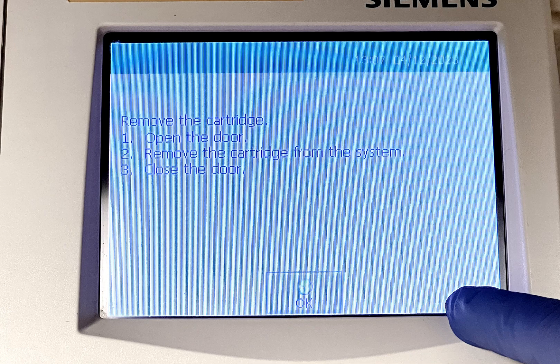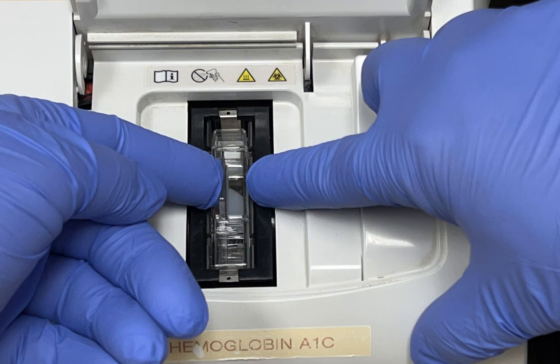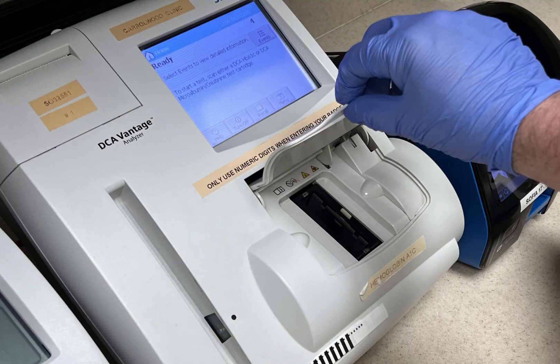The meter will instruct you to remove the cartridge. To remove the cartridge, open the meter door, press down the white button, and at the same time push the tab to the right and pull. Close the meter door and click OK.